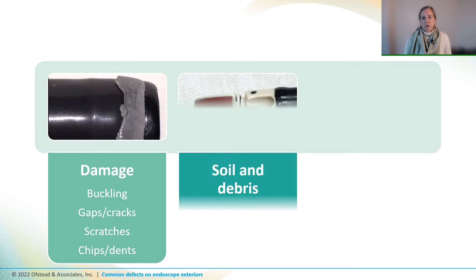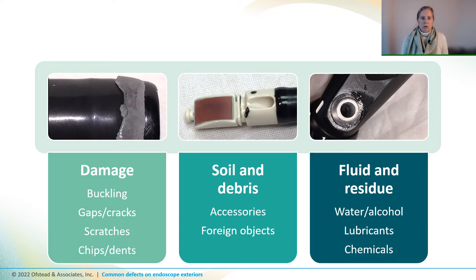In my experience, common defects fall into three buckets: damage, soil and debris, and fluid and residues. Since most components of reusable endoscopes are black, white, or silver, we watch for stuff that's yellow, orange, brown, or red or green, because that typically means they're still dirty.